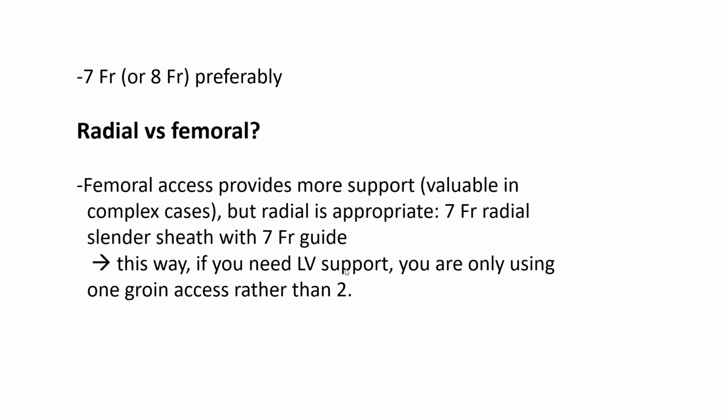This way, if you need LV support, you are only using 1 groin access rather than 2. This idea becomes less important if you are planning on using Impella for hemodynamic and complexity reason, and if you think that you can use single access Impella.